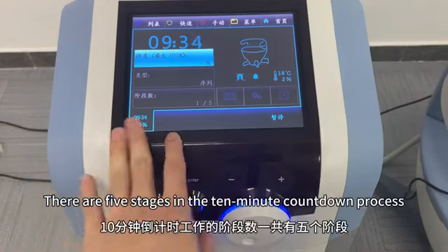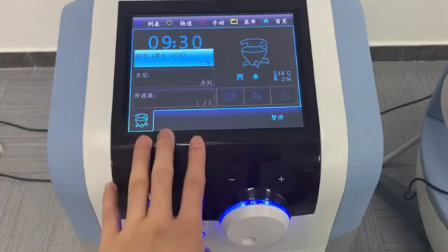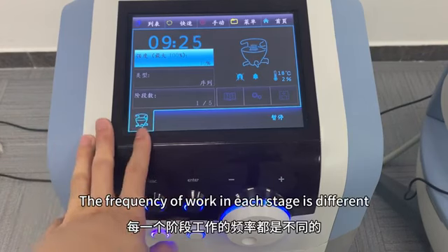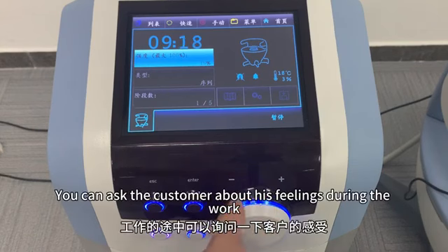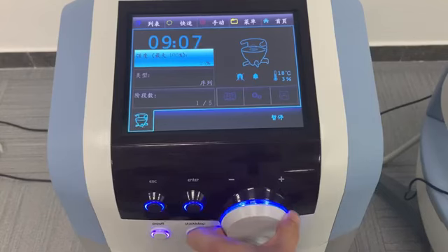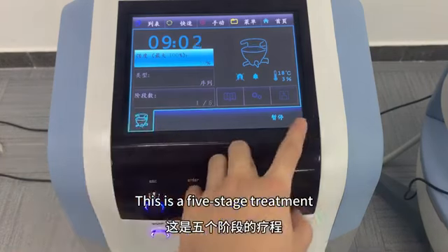There are 5 stages in the 10-minute countdown process. The frequency of work in each stage is different. You can ask the customer about his feelings during the work. If he can accept the current energy, slowly increase the energy to treat him. This is a 5-stage treatment.